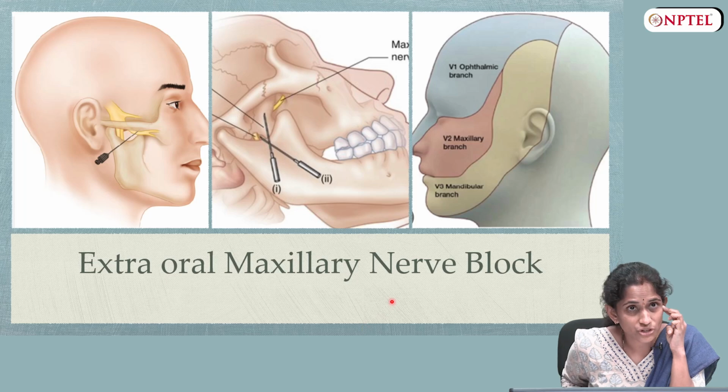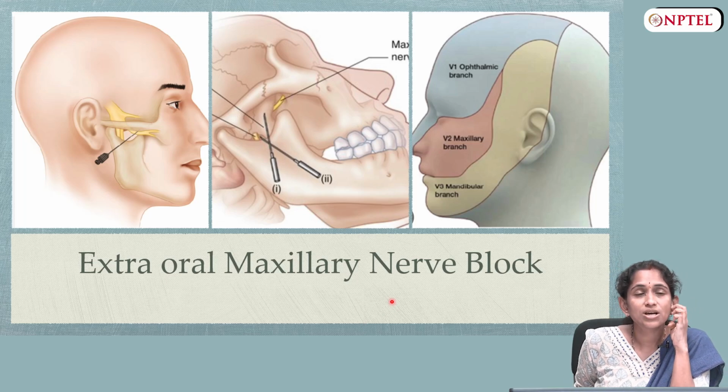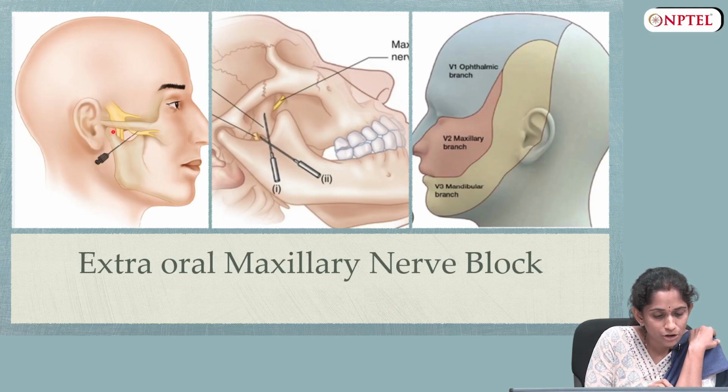So, you ask the patient to sit straight, you palpate the zygomatic arch and the glenoid fossa, and mark the deepest point of the zygomatic arch. You can check that by asking the patient to open and close the mouth. You can also feel the sigmoid notch. What we are seeing here, this curve between the condyle and the coronoid, is the sigmoid notch. So, the first landmark is the zygomatic arch and the deepest point in the center of the zygomatic arch, that is point 1.